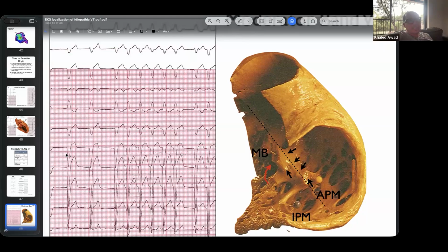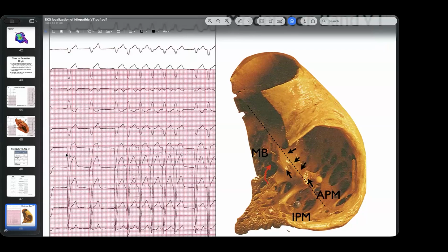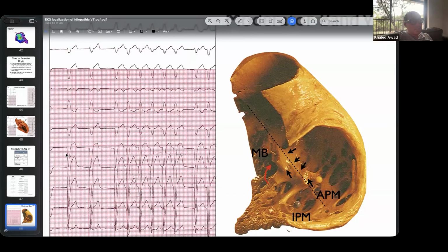If I take a sheath up there, I was taught to keep the sheath right at the tricuspid valve. So the sheath just makes it easier for you to maneuver the catheter a little bit, advance, whatnot. The sheath holds you in place a little bit. I would absolutely advise you not to put a sheath into the RVOT. If you slip or something happens while you're doing that, it's very high risk for perforation in the RVOT.